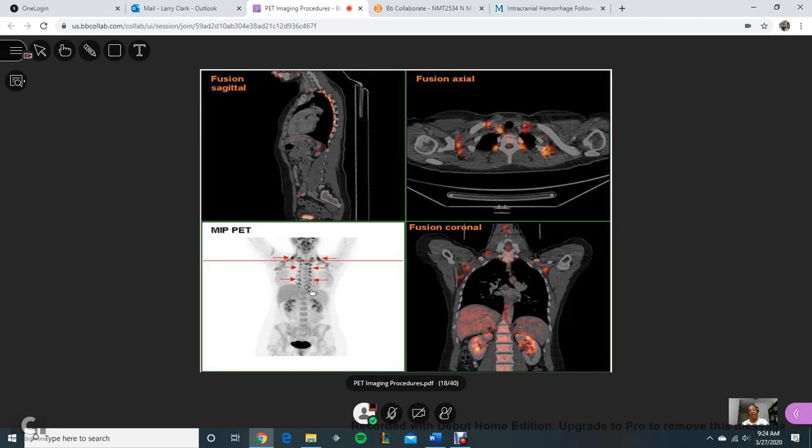That's the difference. And on the top, it's usually on the very top, in the clavicle area. Nothing's really going to be in the clavicle area, and if you do suspect that there is something, it's usually not symmetrical. It's usually diffuse, because metastasis does not show up in a pattern. Does that make sense?